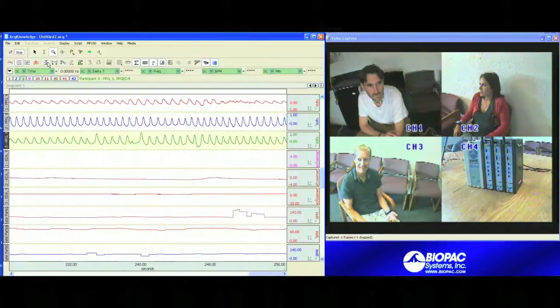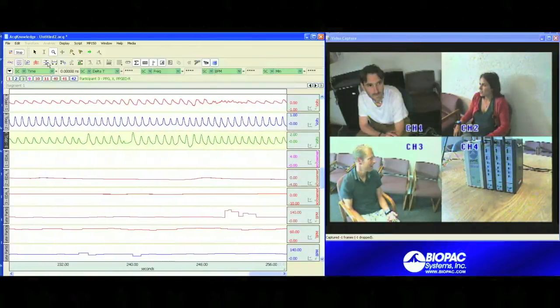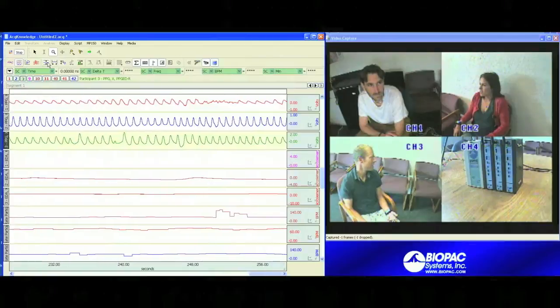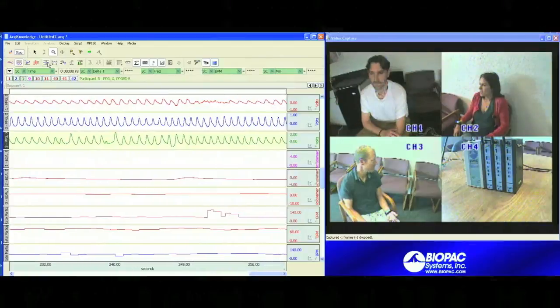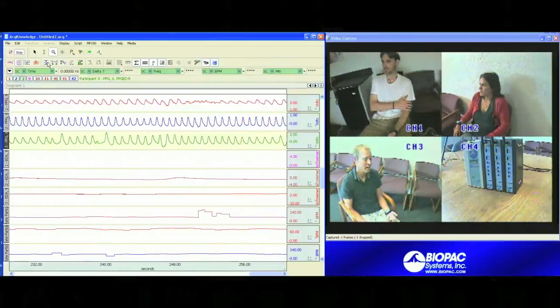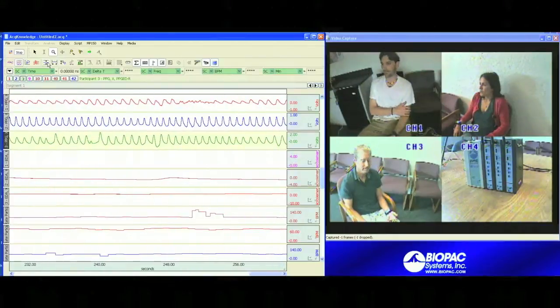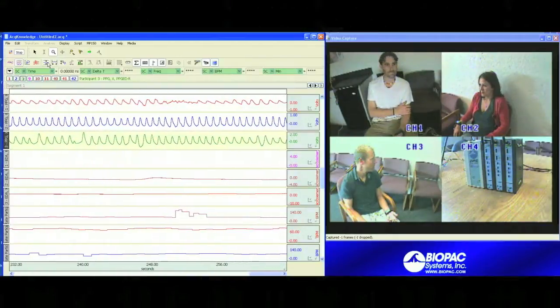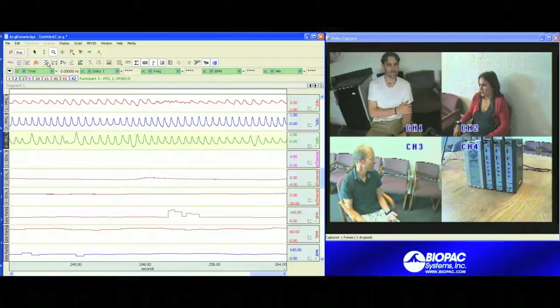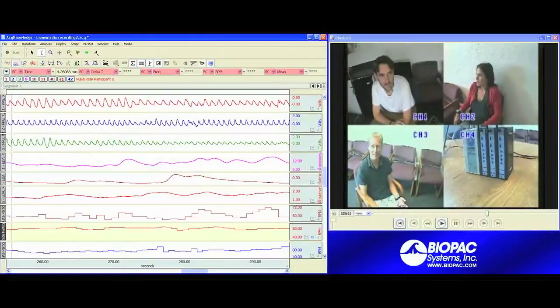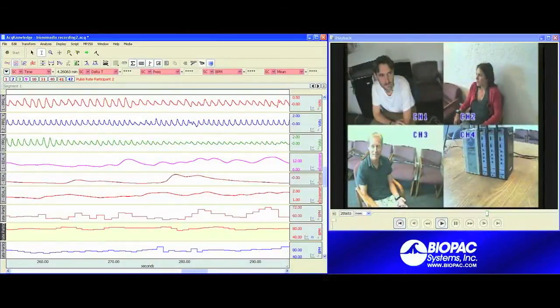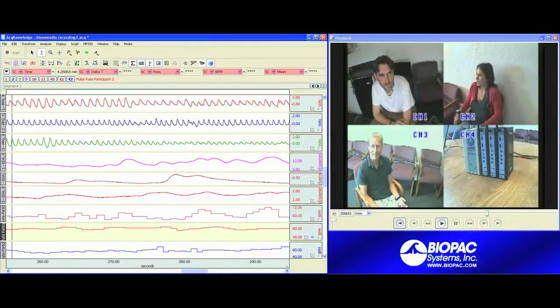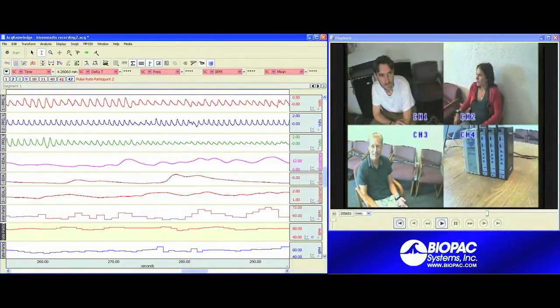Let's take a closer look at the link between the video capture and the physiology data as we take a look at what a data file looks like after you've completed recording. Now that we've finished recording, we can take a look at how the video data and physiology data are linked for analysis.